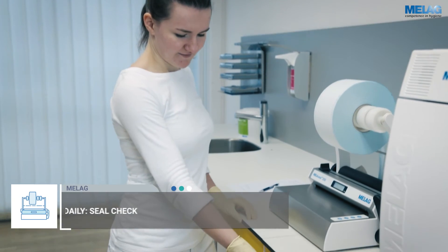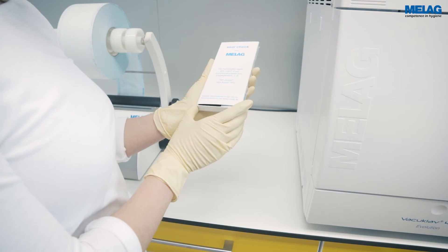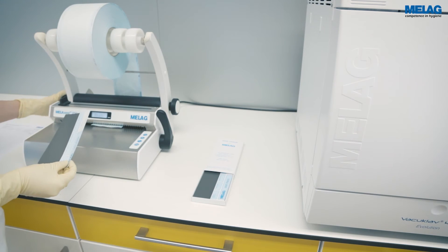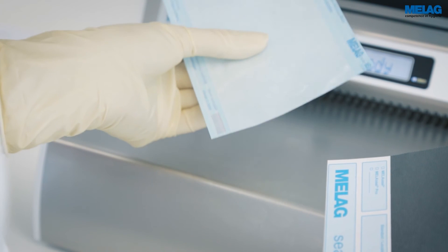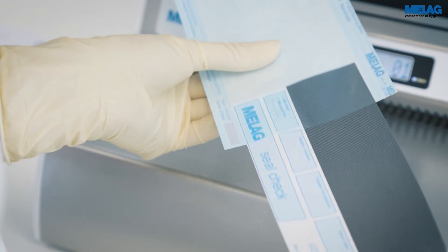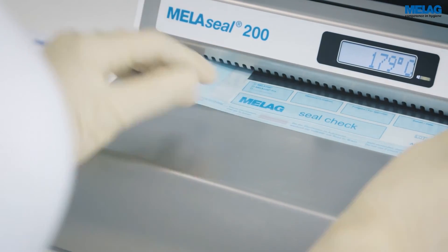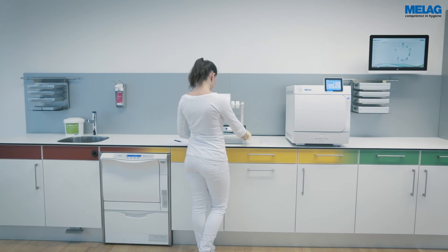Moreover, control the entire sealing area using the MieleG Seal Check. Please insert the seal check in the sterilisation packaging so that the grey test field is visible through the transparent foil. Slide the sterilisation packaging into the sealing device with the foil side pointing upwards. Make sure that the seal seam generated runs centrally across the entire test field.